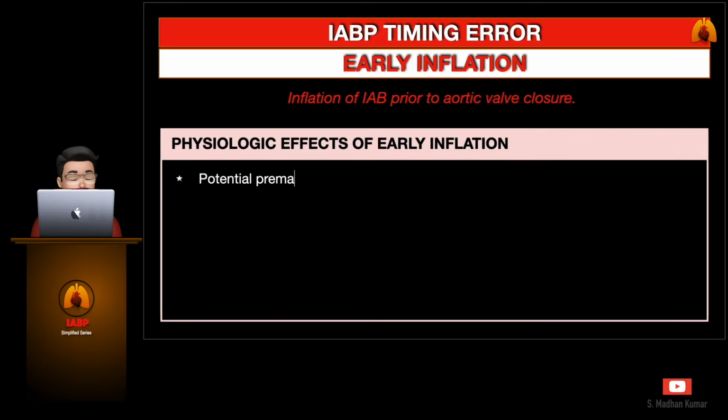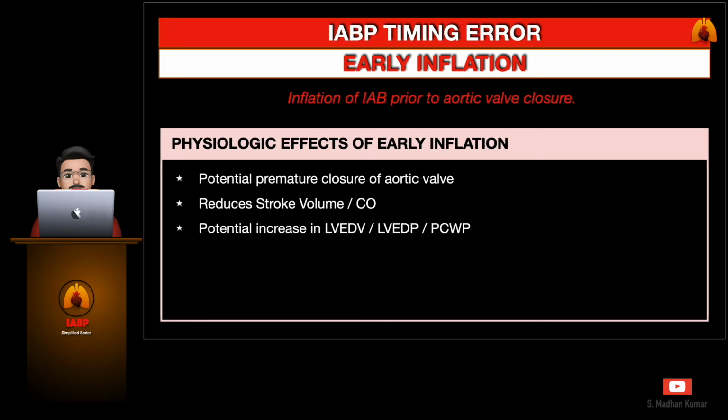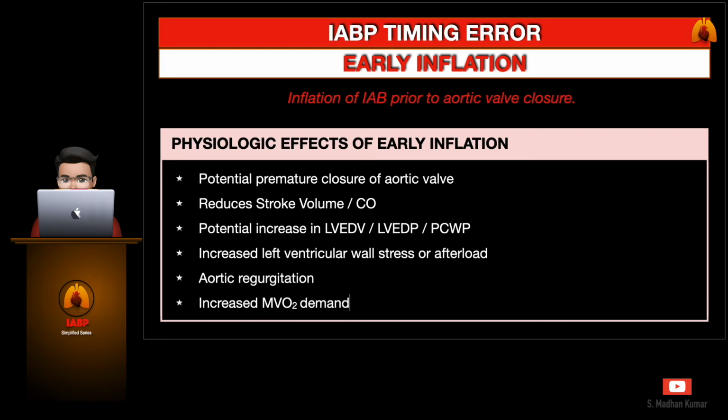The physiologic effects of early inflation are potential premature closure of aortic valve, reduced stroke volume or cardiac output, potential increase in LV-EDV, LV-EDP and PCWP, increased left ventricular wall stress or afterload, aortic regurgitation, increased myocardial oxygen demand.